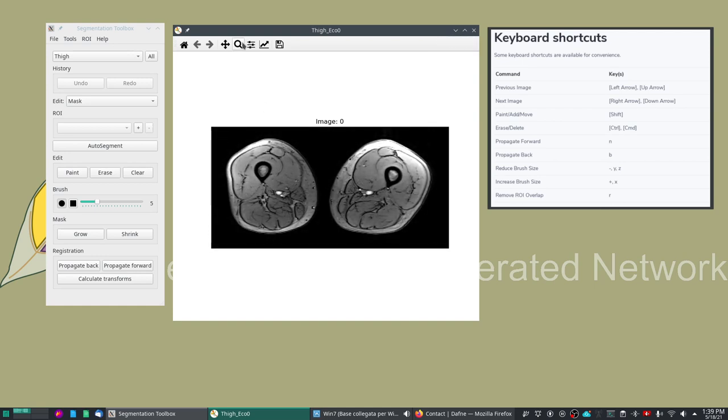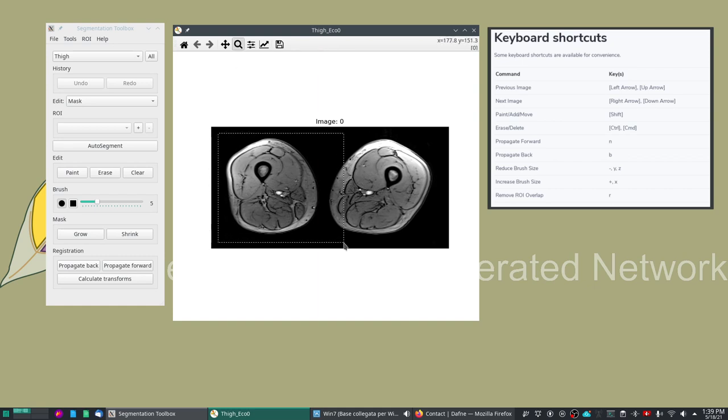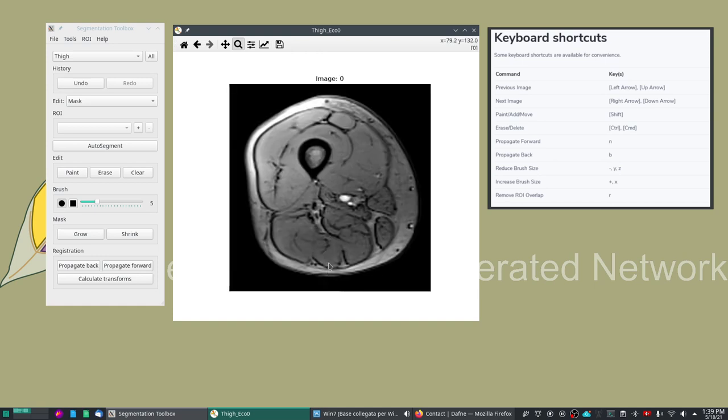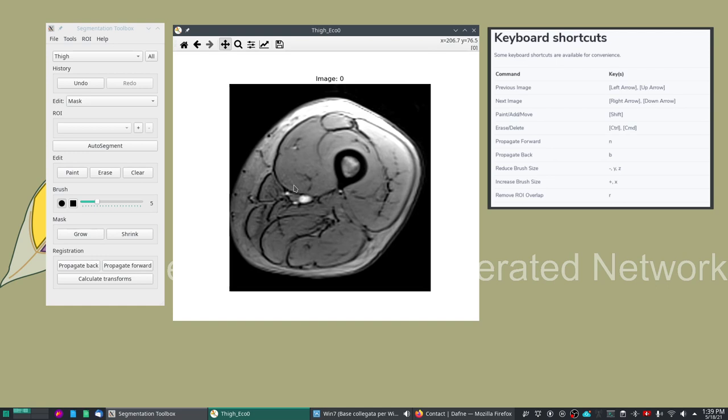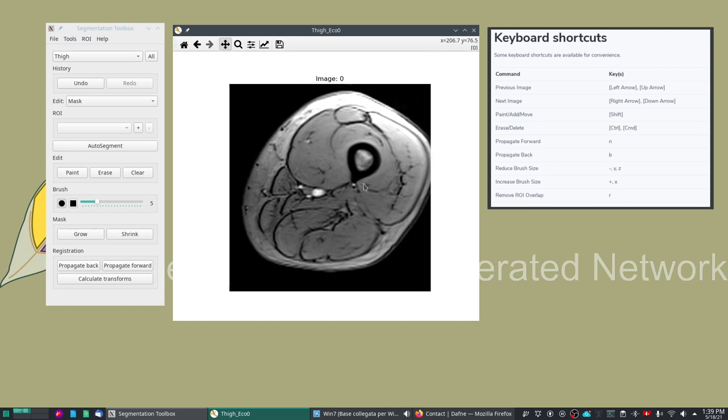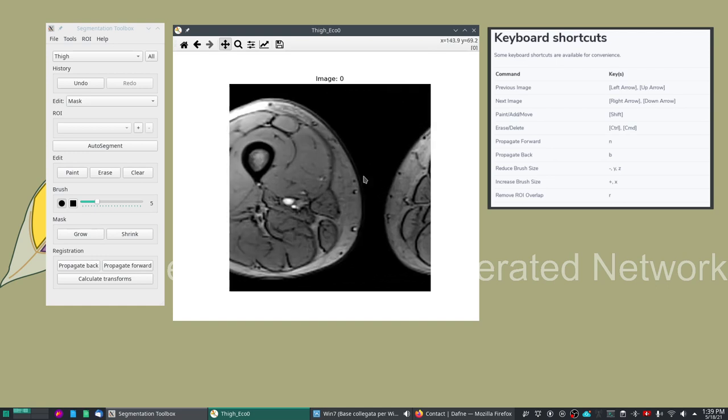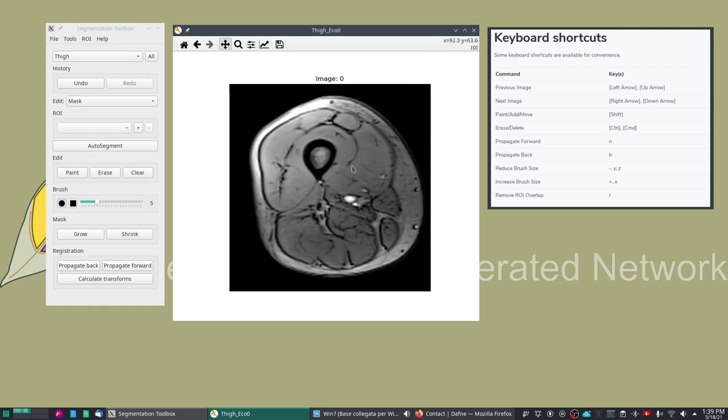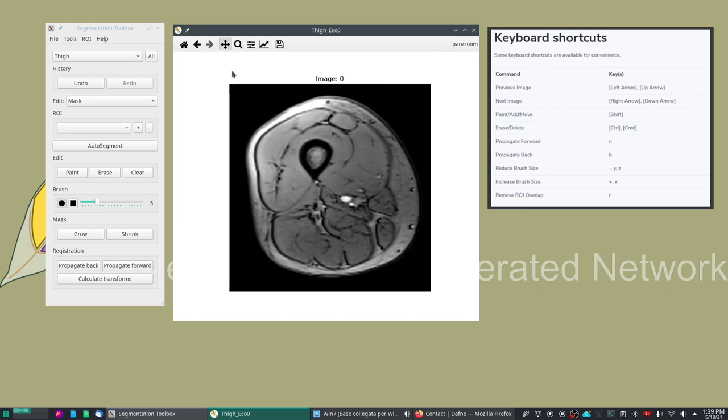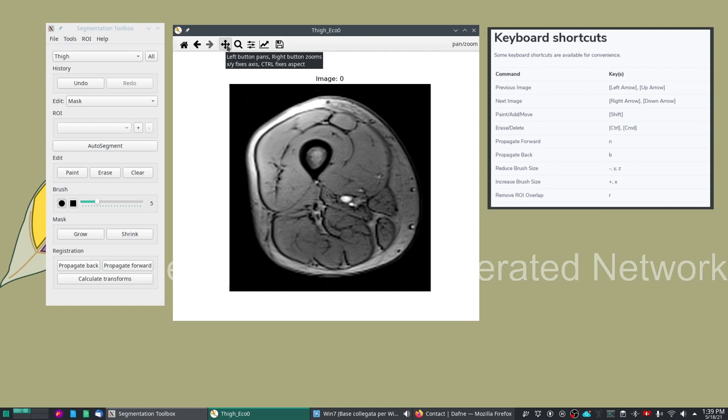We also have the possibility of zooming in and out. This is the zoom tool, so for example we can take one single leg or we can use the pan tool to change to a different place.